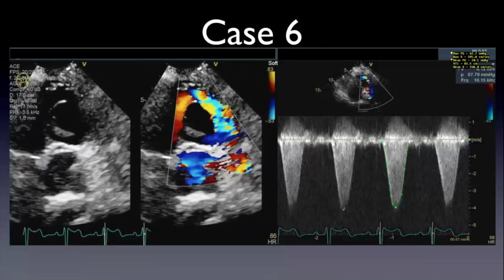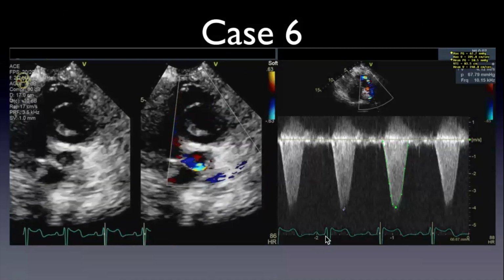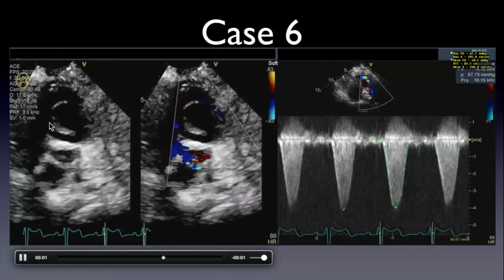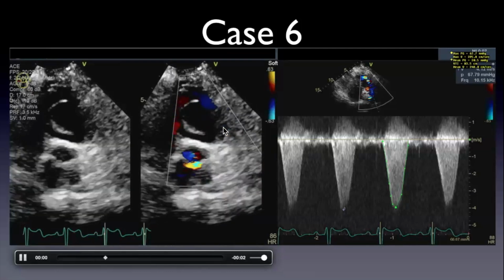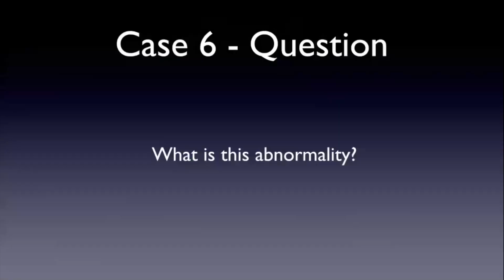There's something kind of sitting inside this structure. I don't know what to make of it. It could be somehow compressed in the RVOT. See here, whatever the structure is, it's projecting into the RVOT and causing obstruction. So what's the size about?